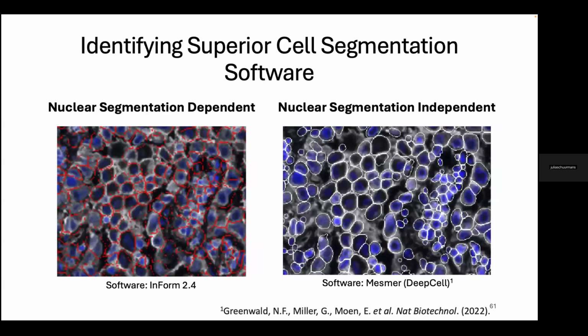If we look at this image here, we'll see over here that the lymphocytes are being accurately outlined, as well as our larger tumor cells in here. They're even getting cells here that did not have a nucleus in them, which is helpful because sometimes you miss the nucleus in our plane section. Versus over here, this is a mess. Everything is missing an outline. This is one massive cell.